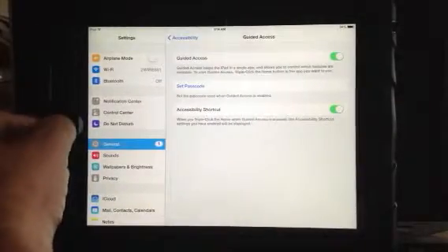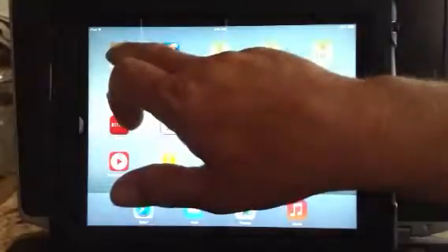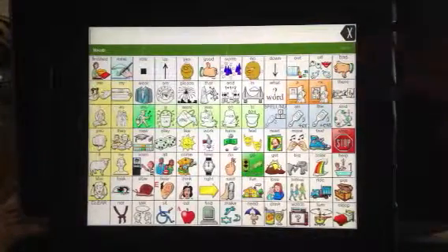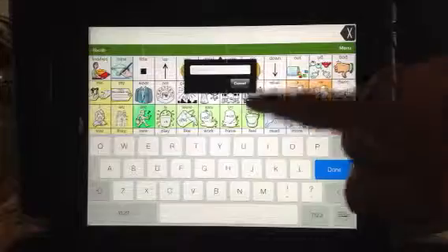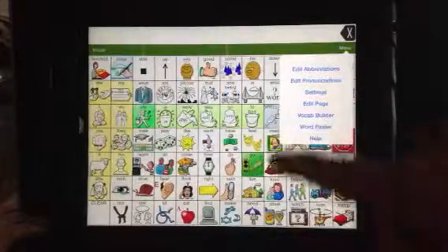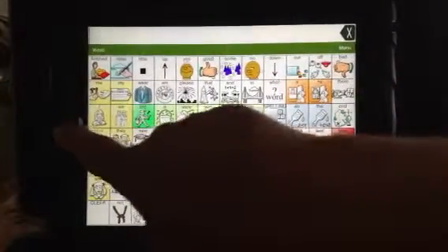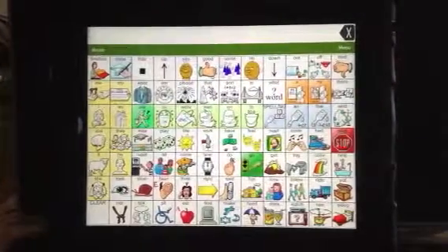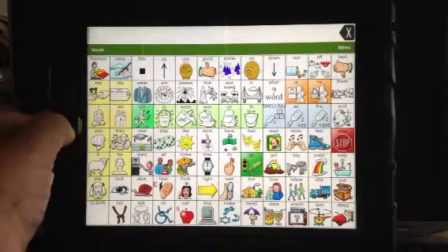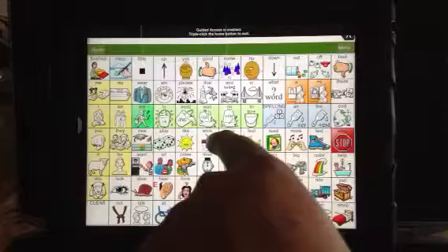Now let's go back to Words for Life and see how you'd use this. I'm back in LAMP Words for Life. I don't want the child touching the menu, I don't even want him getting to that spot at all. I don't want him hitting the vocabulary, and I don't want him hitting the Home key to get out. So now I'm going to touch the Home key three times fast — and it says Guided Access has started. It was that quick.